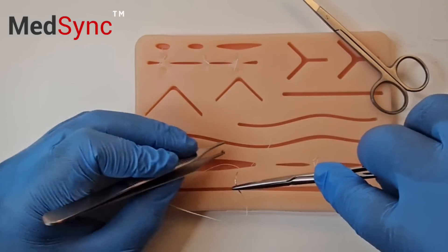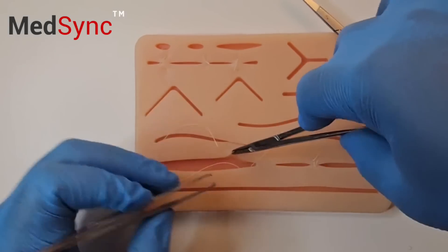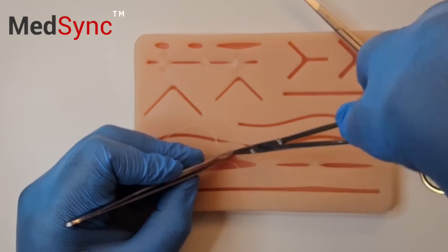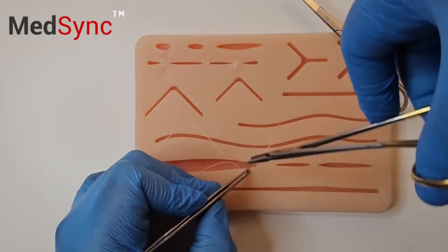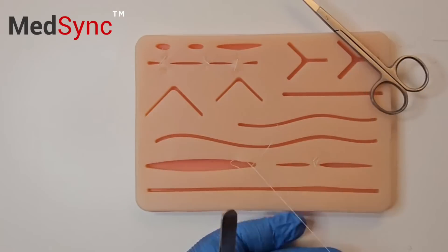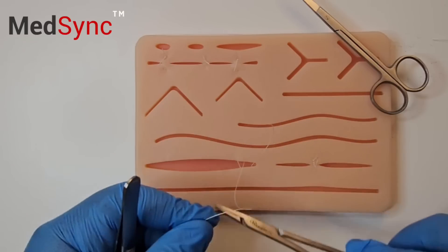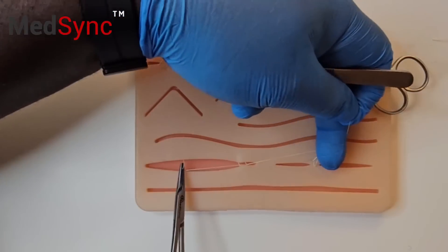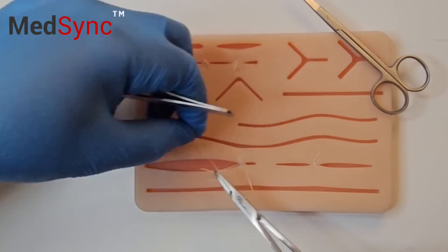Palm your instruments. You tie your knot in parallel rather than perpendicular — a surgeon's knot, followed by two reef knots.